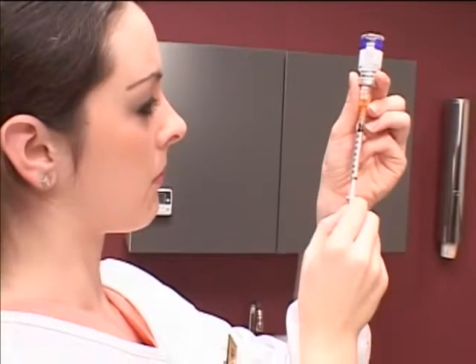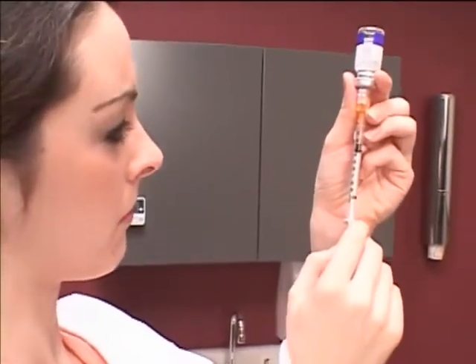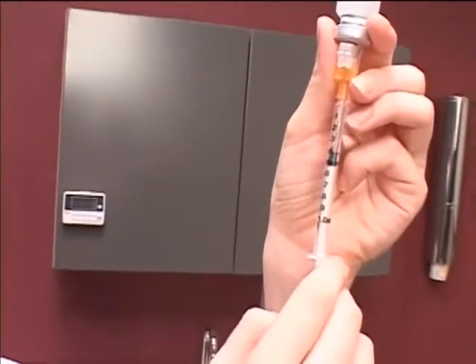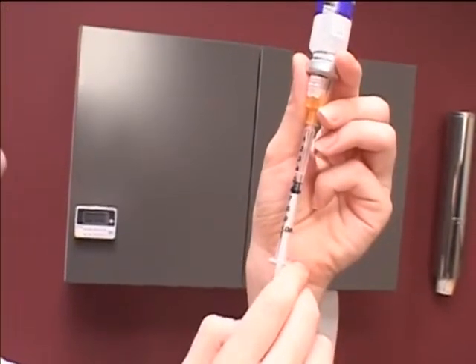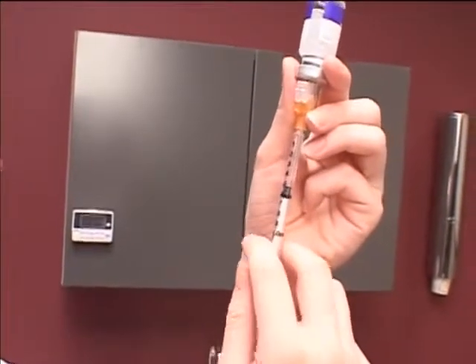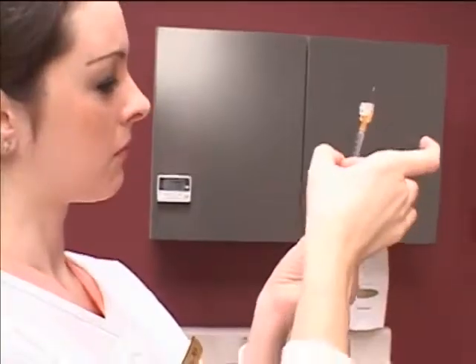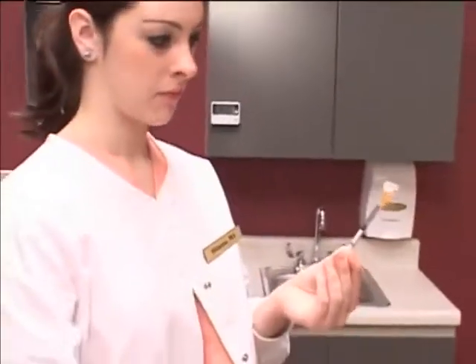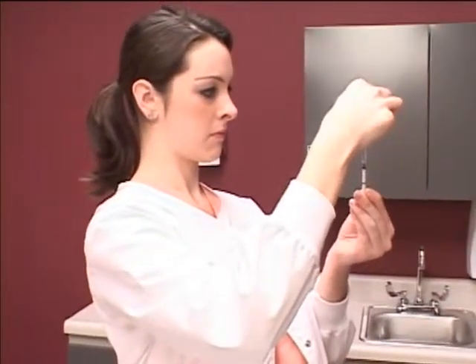Invert the vial and raise it to eye level. Slowly, using gentle negative pressure, withdraw the medication. Keep the needle tip in the liquid to prevent it from drawing in air. When the appropriate dose has been reached by volume, slowly withdraw the needle from the vial. Gently flick the syringe to remove any air bubbles. To keep the needle sterile, follow your institutional policy when recapping needles.